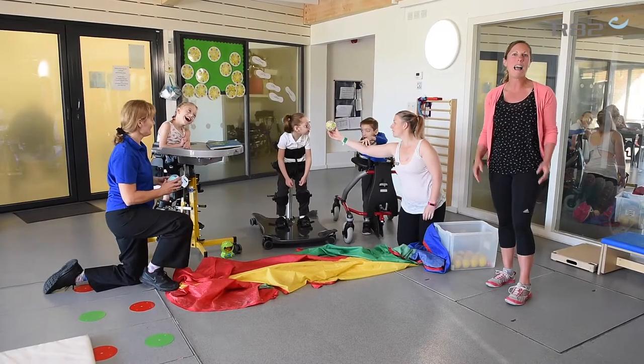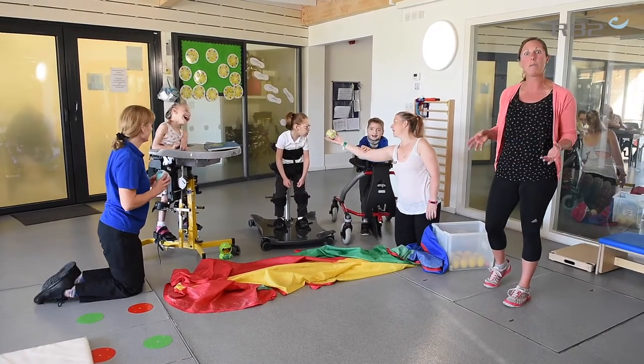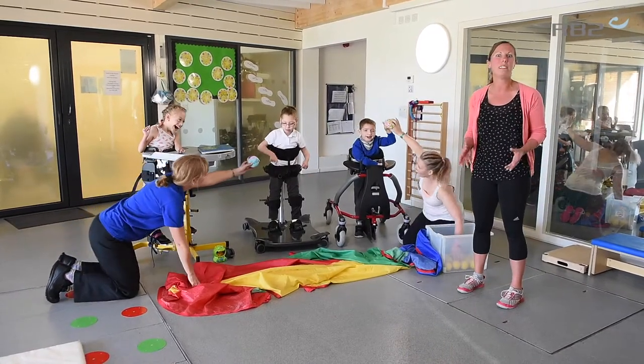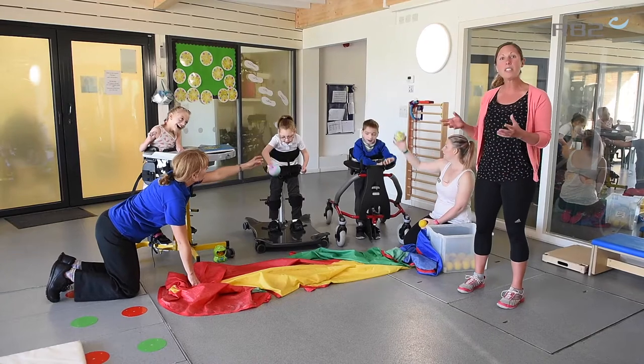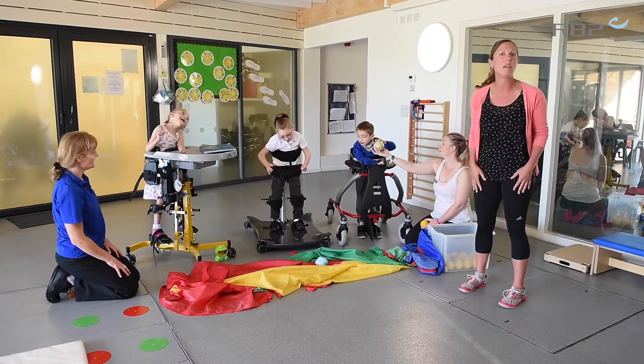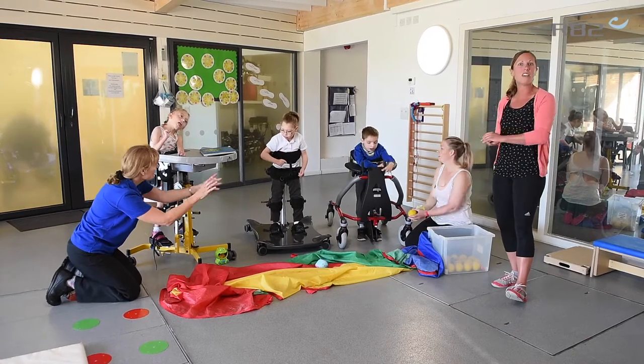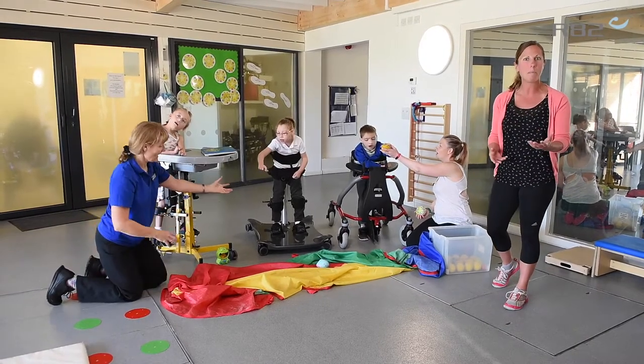Hi, I'm Frances and I'm here to talk to you about how the Meerkat fits in with my therapy programs. In this video, I'm interested in developing a child's movement and their motor skills. What I use at the minute is something like a static stand to align that body position, but I'm also transitioning to something like the Mustang for walking and getting that movement and stepping.